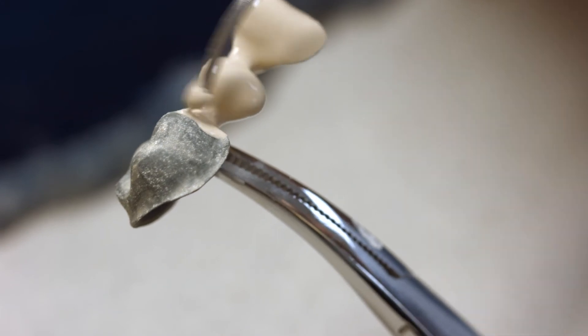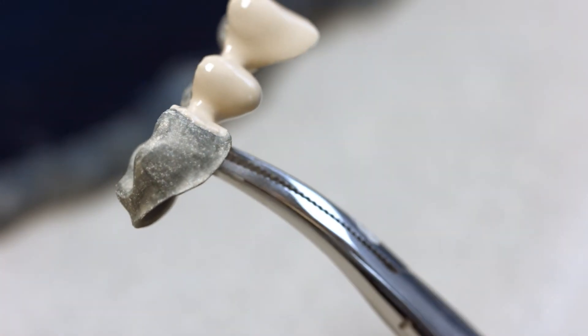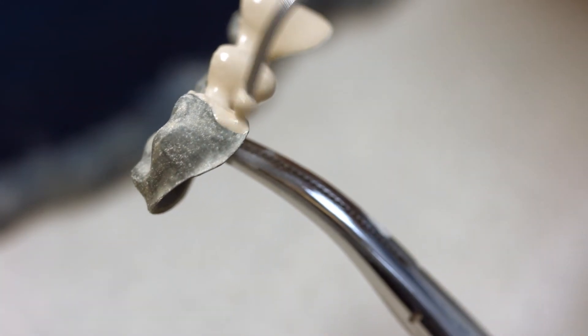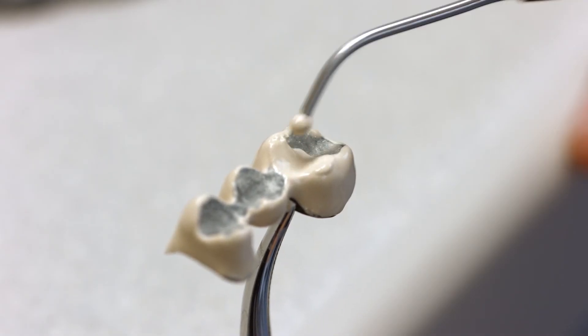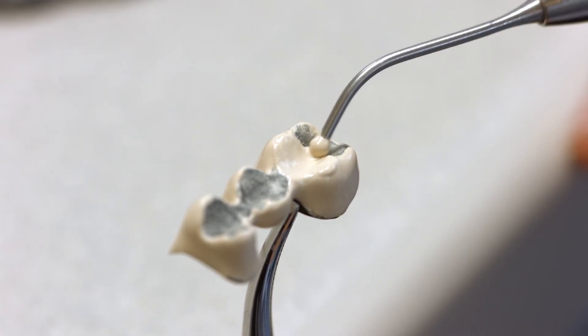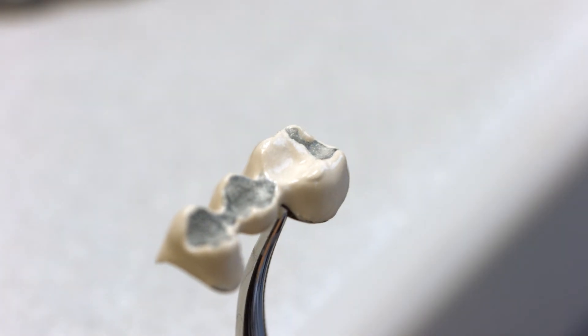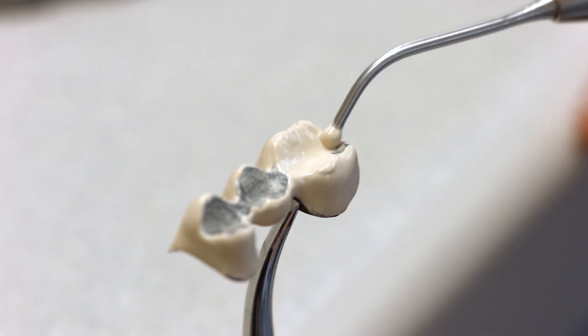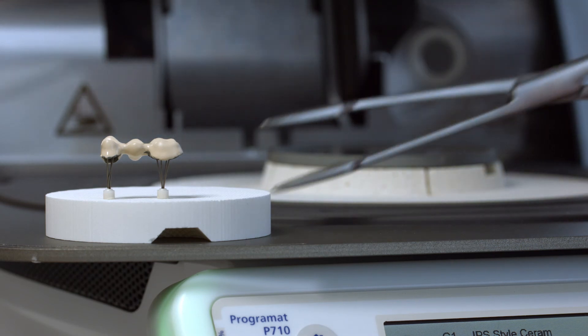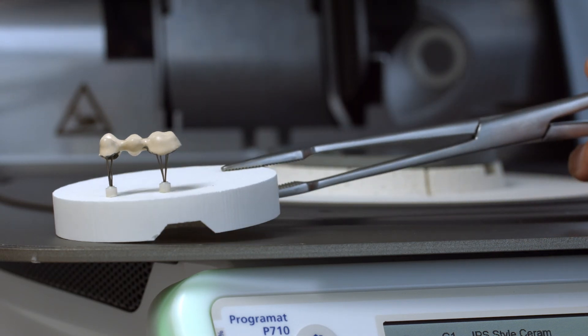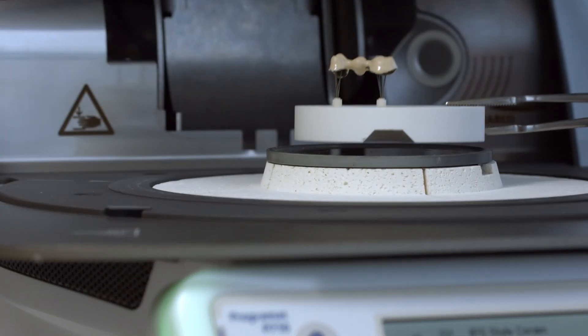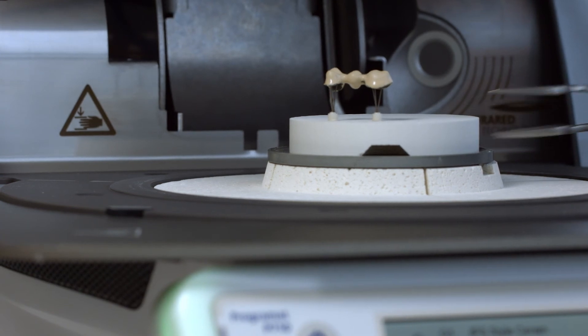The veneering surfaces of the alloy framework must be entirely covered with opaquer. Shade adjustments can be made with IPS Style Ceram Intensive Powder Opaquer before the second opaquer firing. Once the adjustments have been made, the restoration is ready for the second opaquer firing cycle.